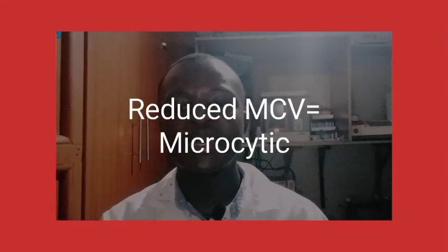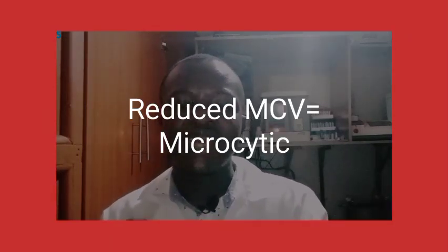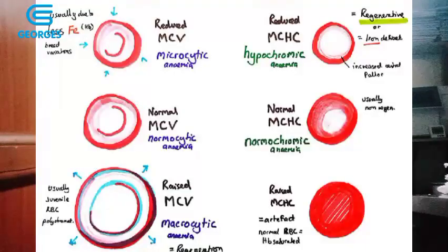Decreased or a small MCV, we will call microcytic anemia. When it is increased, we will call it macrocytic anemia.